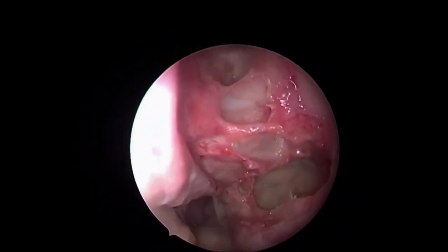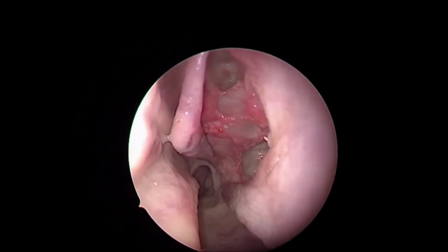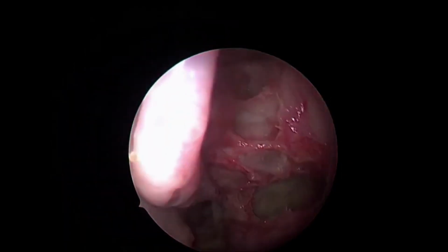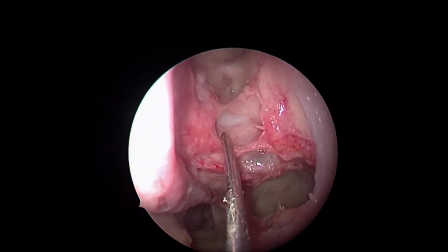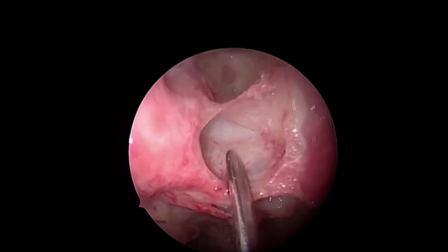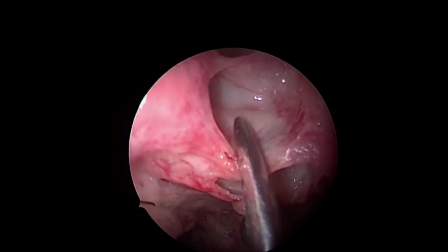So what are we left with on the sinus surgery on this side? The post-ethmoidectomy and sphenoidotomy. I can go on through this ground lamella. See this? This is the ground lamella. If I go behind this, the posterior ethmoids are supposed to be there, and behind that the sphenoid sinus, but it's not always like that.